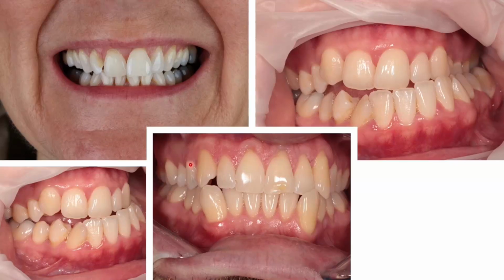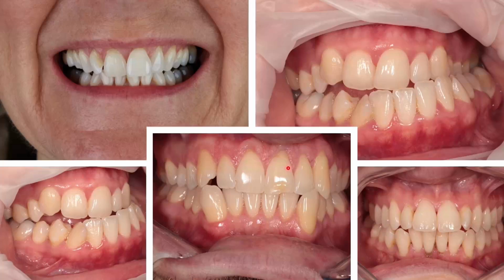And that is a case that would be extraordinarily hard to deliver with clear aligners. And in fact, I did actually refer that case for a specialist orthodontic assessment, and it's currently under treatment. It ended up requiring extraction of 2 lower second premolars and about 2.5 years worth of fixed appliance therapy. So those severely crowded cases, particularly with roots lying in the wrong direction, they're best avoided.